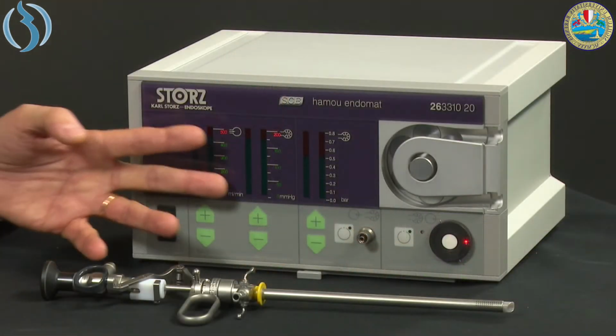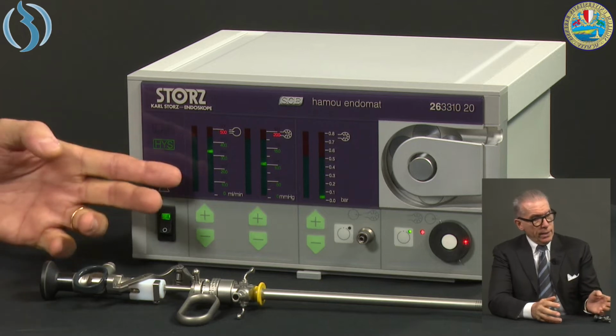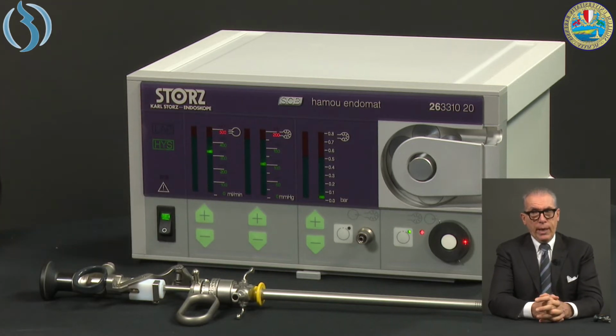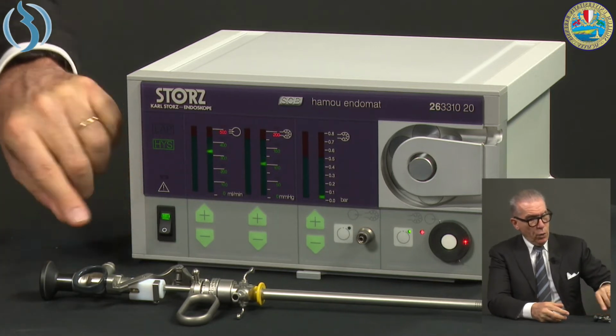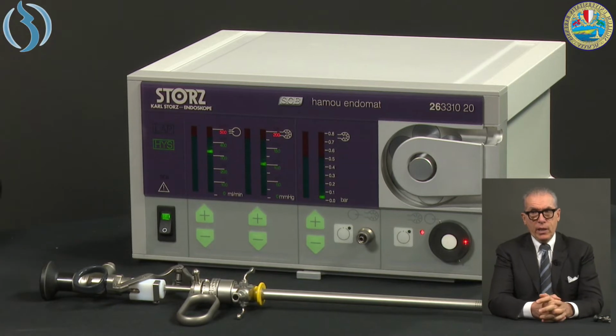Then on the front panel, we have the on-off button here. There we are, the three beeps that tell us the pump did its check and everything is working properly. And then the three couples of plus-minus buttons that are used to regulate the parameters, the default parameters. Until the lamps blink, it means that the pump is not fixed. As soon as we confirm or modify the setup, the pump takes its position and is ready to work.